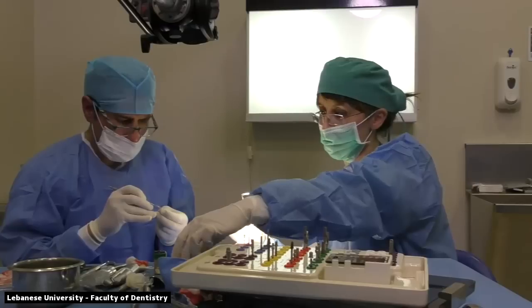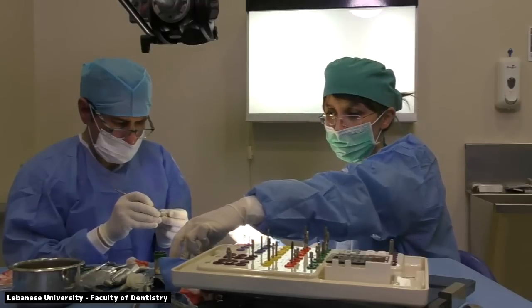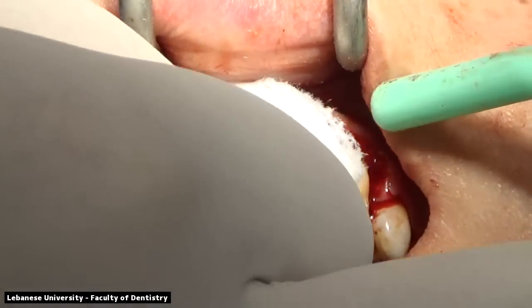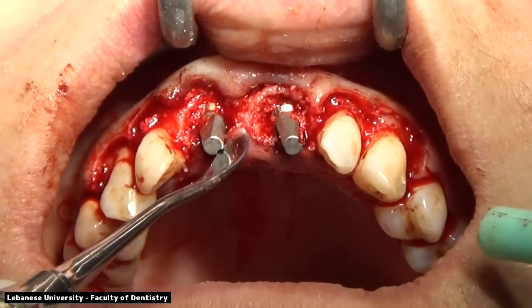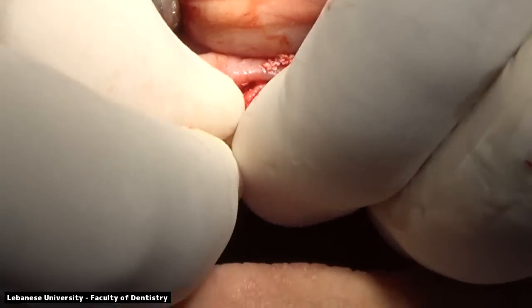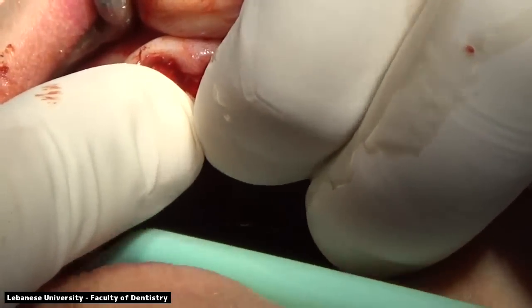Minimal amount of temporary cement is being placed with a small spatula. Drying off the abutments, packing the bone, the areas where you want it to be, making sure that the palatal and the buccal mucoperiosteal flaps are elevated so that once we place our temporary restorations, they go all the way to the tip of the abutment area and they're flush with both abutments on the right and the left side.